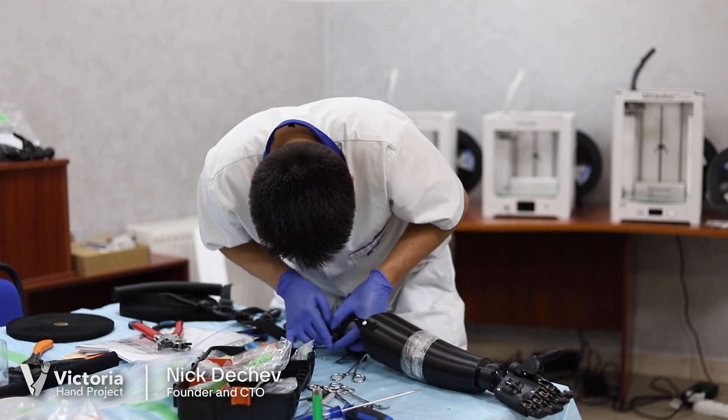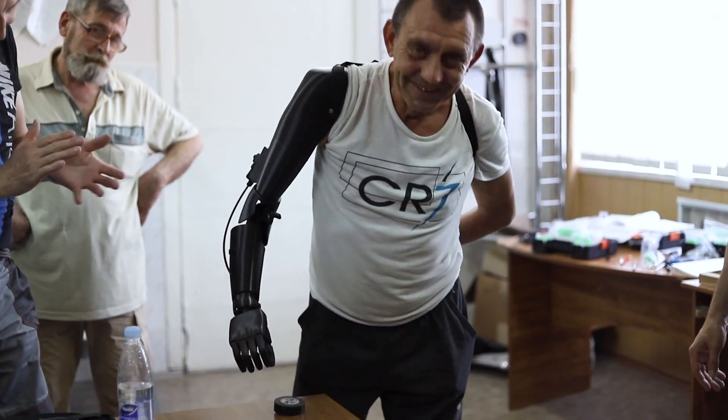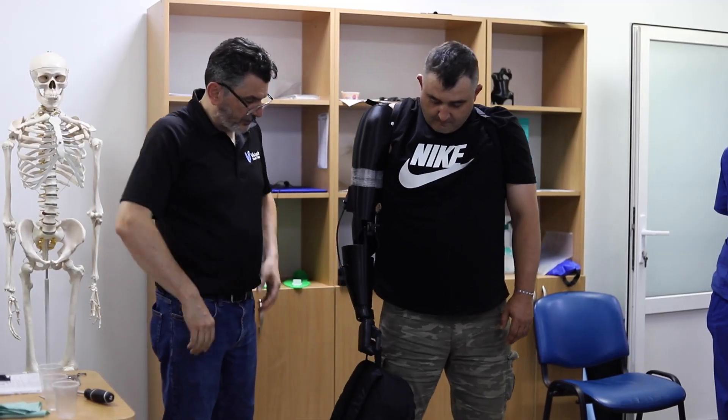My name is Nick Dechev. I'm the founder and chief technical officer of Victoria Hand Project. Victoria Hand Project's mission is to help people all over the world who are unable to have the resources to get prosthetic care.